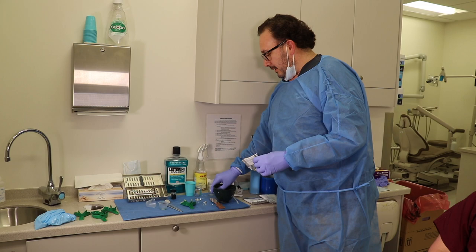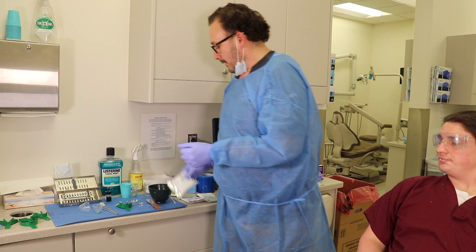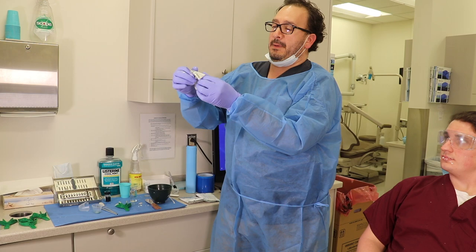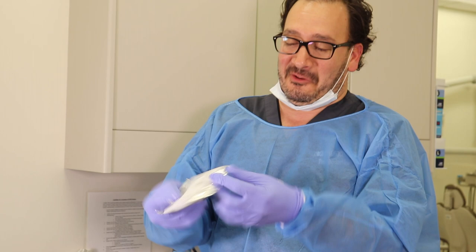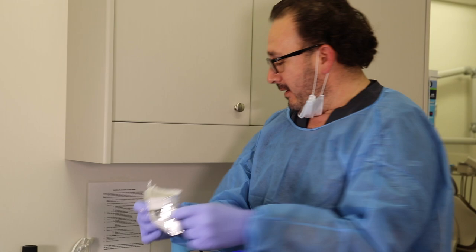And we repeat the same process for the lower. I'm gonna show you a couple of tricks that we're gonna do on the lower. But now let's take the lower impression. Again, we got the alginate. Some people will open it as if it was a bag of chips or in a hamburger way. I like to open it in the hot dog way. You see, I learned that last year with the D2 students. So hot dog way, very nice way to do it.